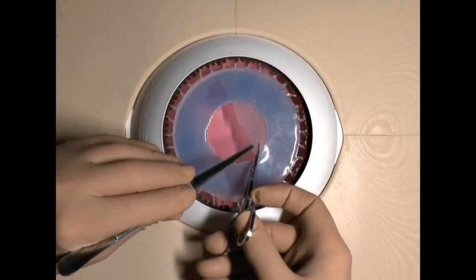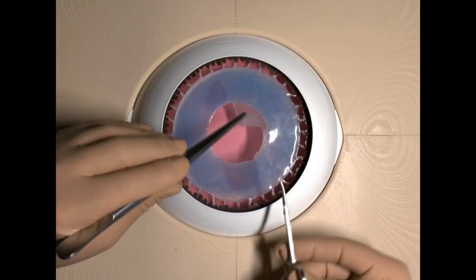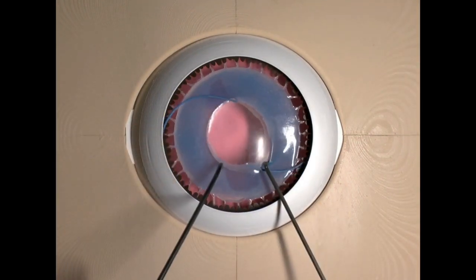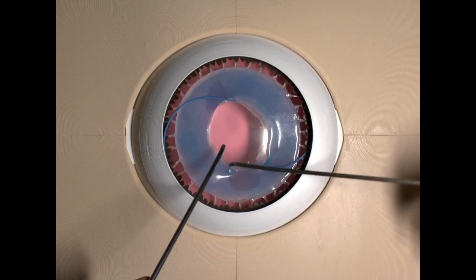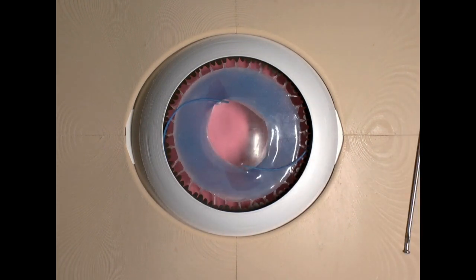Extensive damage or poor visualization of the posterior capsule with intact anterior capsuloraxis is an ideal opportunity to implant a three-piece lens in the sulcus with optic capture.